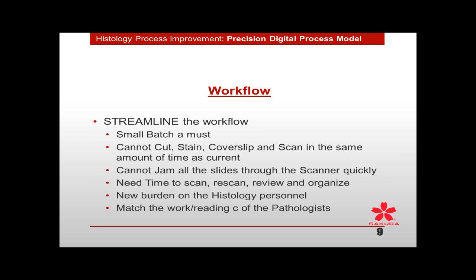You cannot cut, stain, and coverslip and then scan all in the same amount of time. If your department is turning out 100 blocks a day and maybe 300-400 slides, you can't wait until those 300 slides are completed and then decide how you're going to scan. You'll create a tremendous bottleneck and stop things, and your customer, the pathologist, is not going to be agreeable with that. And you can't jam all the slides to the scanner quickly.